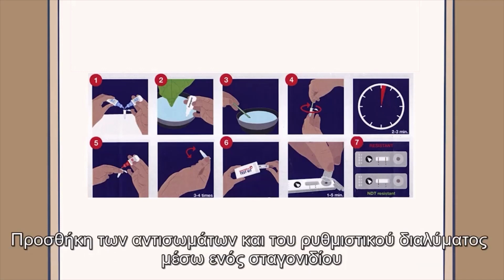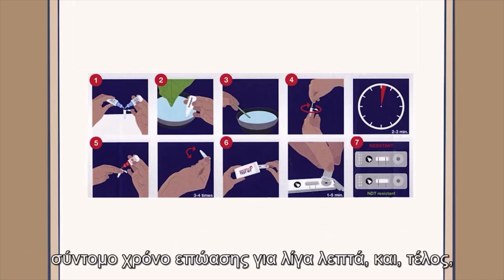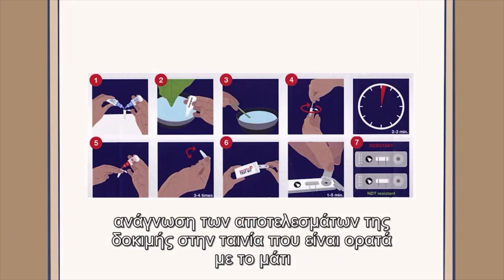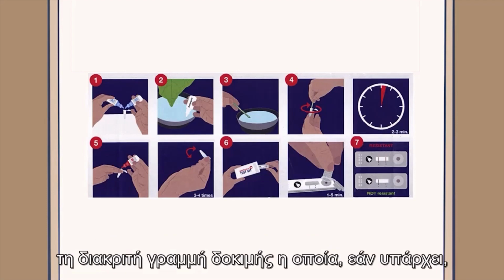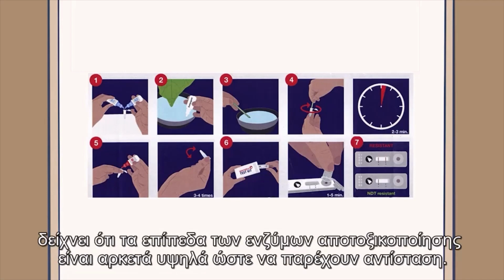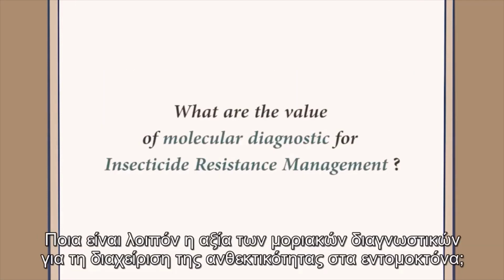Addition of the antibodies and the reaction reagents using a droplet, short incubation time for a few minutes, and finally, reading of the visible test results on the strip by eye, where a control line indicates the correct technical procedure and a distinct test line which, if present, indicates that the levels of the detoxification enzymes are high enough to provide resistance. So what is the value of molecular diagnostics for insecticide resistance management?